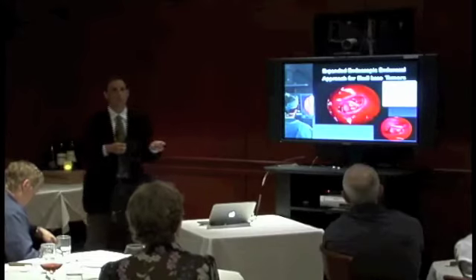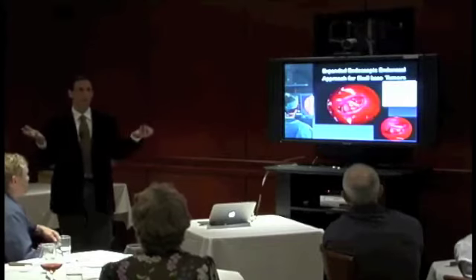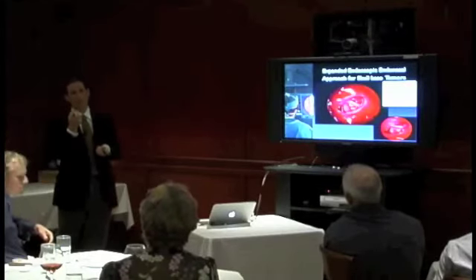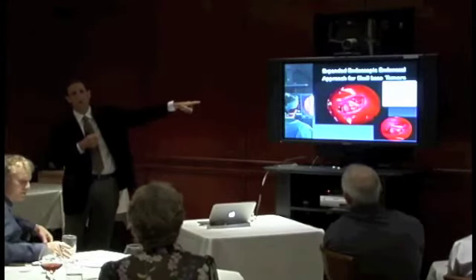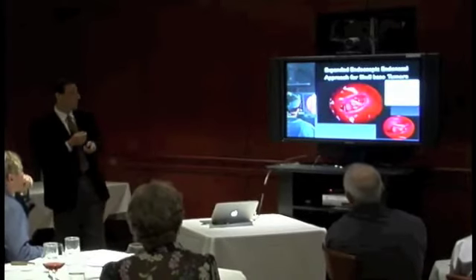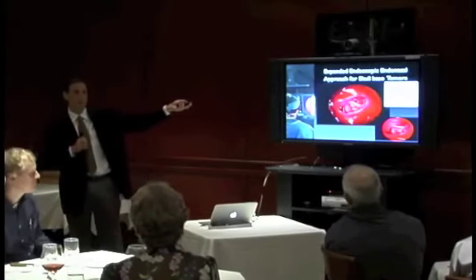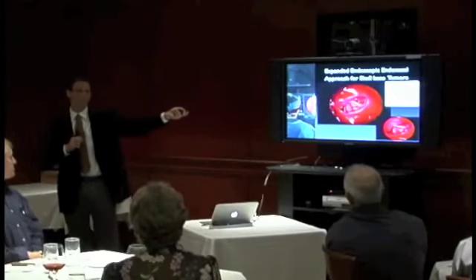Do you remember what type of tumor it was? This actually was a fibroma this patient had. So it was very strange. And this thing was calcified. It was one of the scariest cases I've done, because the tumor was so calcified and firm, I was actually using a drill at that location, drilling tumor off of the brainstem. It was very scary. Hopefully I'll never have to do one of those again, but the patient ended up doing fine. But again, the proof is now we're looking at the brainstem at the end of this procedure. We put a patch in there. That patient was in the hospital for 2 days.